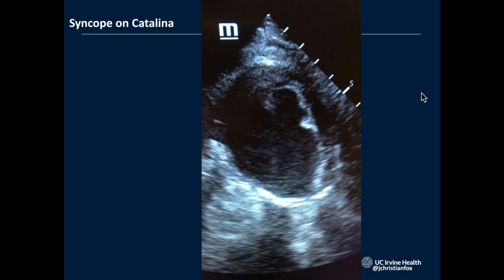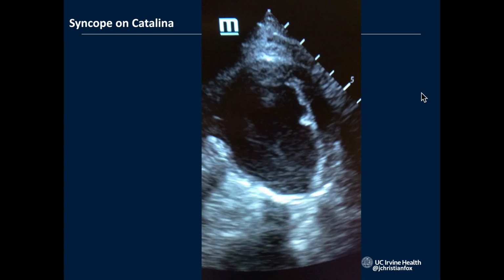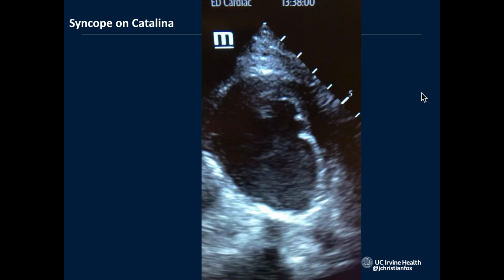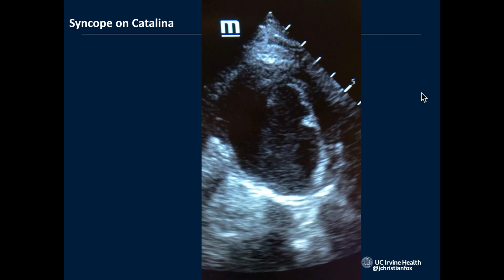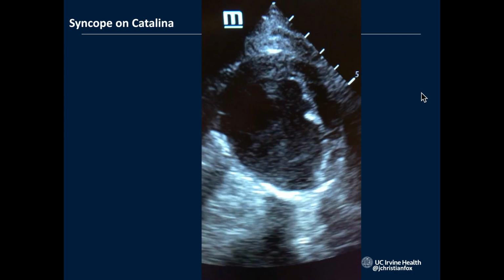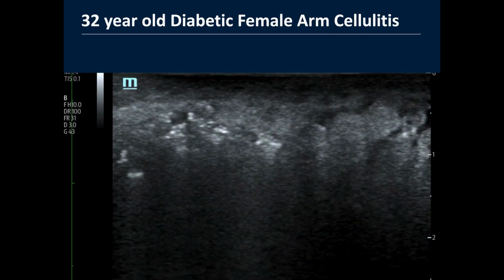And the call I got was, "Hey, this is what I think it is, what I'm looking at, right?" And I looked at this video taken with an iPhone, and I said, "Absolutely, get that patient off your island right away. That is an aortic aneurysm." Again, syncopal episode, abdominal pain, back pain, groin pain. Think about that.